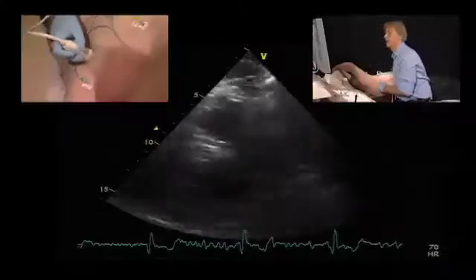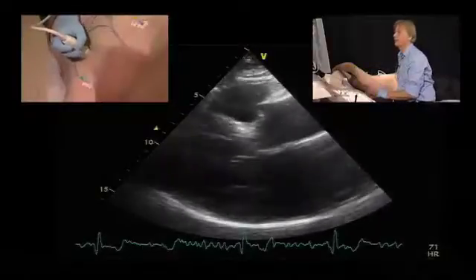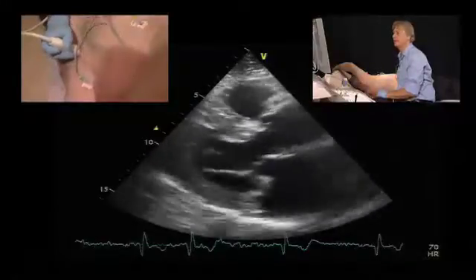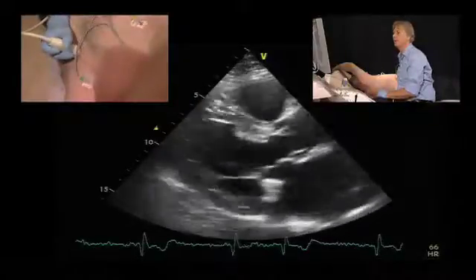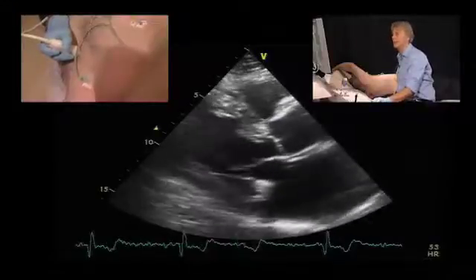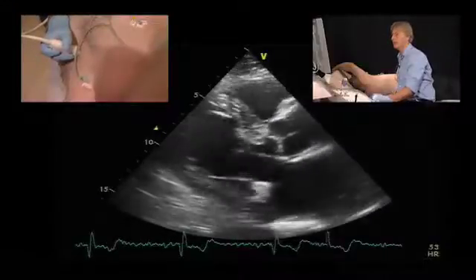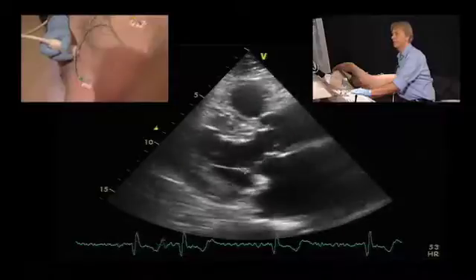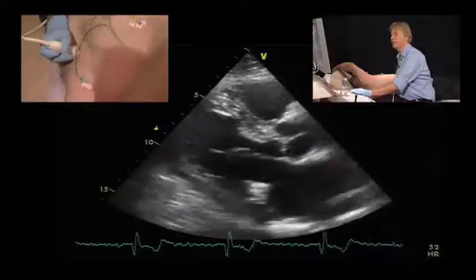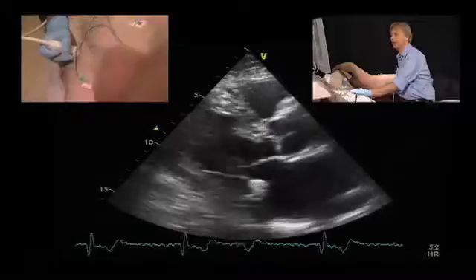Here we have a 62-year-old patient. I want you to take a look at the echo first. We will start with the parasternal long axis view, and I am sure you will immediately recognize where the problem is. We have a structure here in the region of the posterior leaflet which is abnormal.